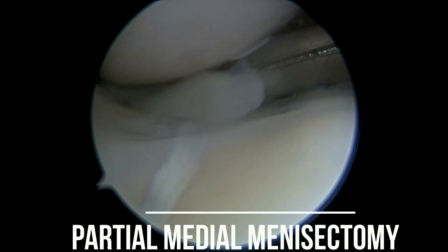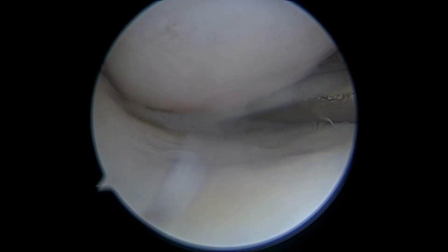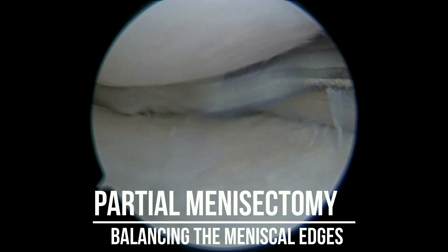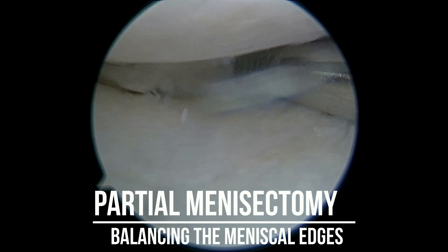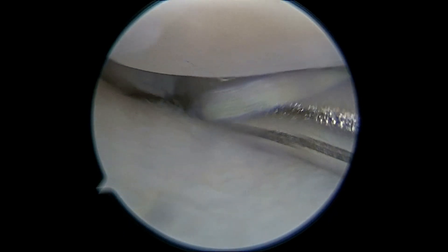A shaver is introduced inside the joint and the meniscal portion that has been removed from its main body is shaved off completely. The shaver has a powerful negative suction device attached to it, which shreds the pieces of the removed meniscal portion into small fragments and takes them along with the suction. This is followed by balancing of the meniscus body, which helps prevent recurrence of any tear from loose sharp edges coming between the bony surfaces. Balancing forms an essential part of the surgical procedure.